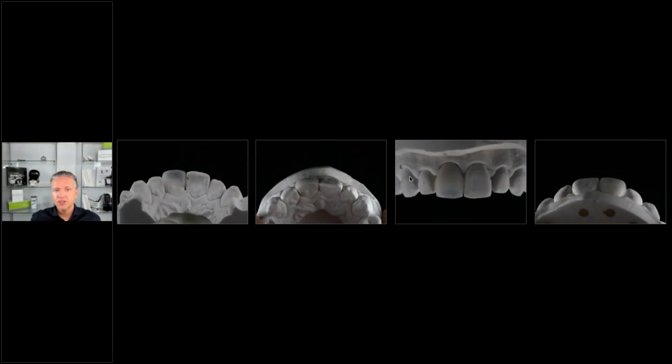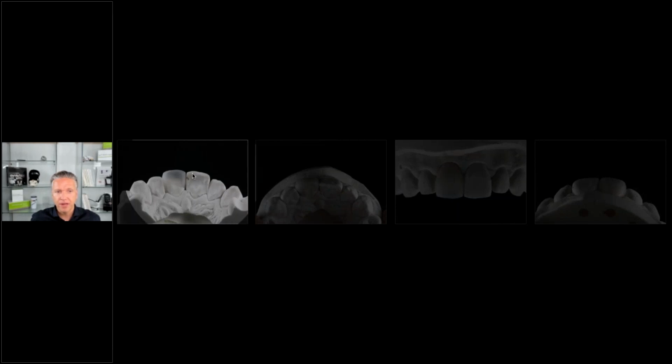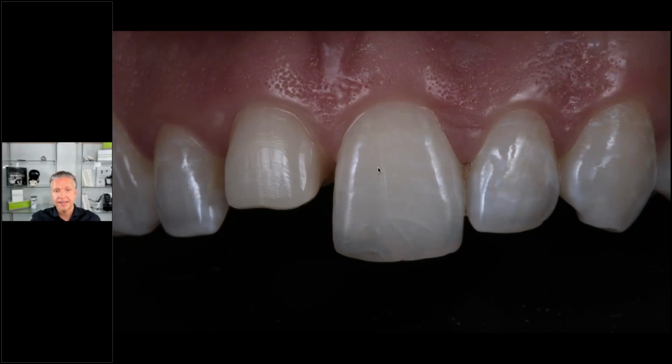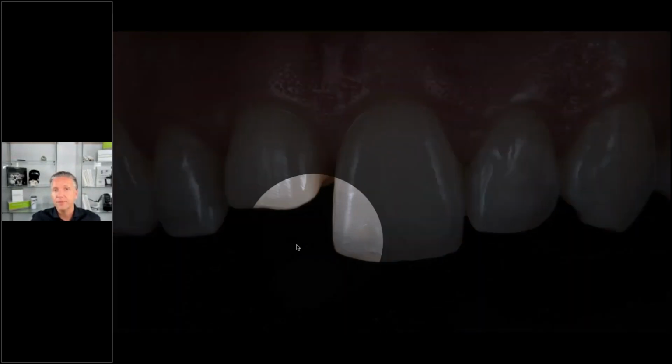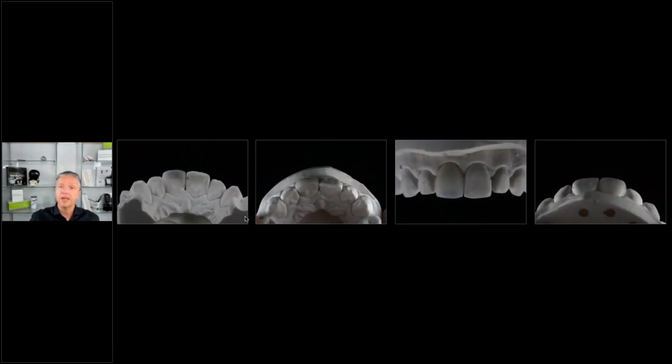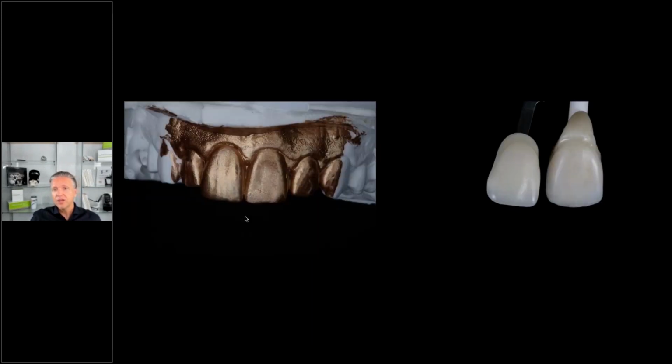I then scoop out the lingual of that area as thin as possible, because I have to establish that shape, basically that stump, the dentin. I have to establish it from the lingual. So I'm basically going to scoop it out. I've fitted everything on the model, and I'm layering porcelain, lingually dentin porcelain, into that veneer to match that color. And I'm working again with my paste here, with a bronze color, silver color paste, to match the anatomy, the morphology and surface texture.